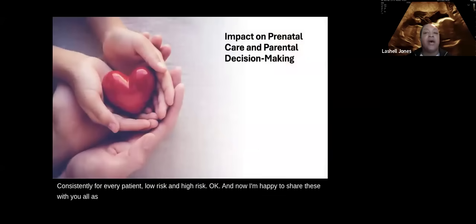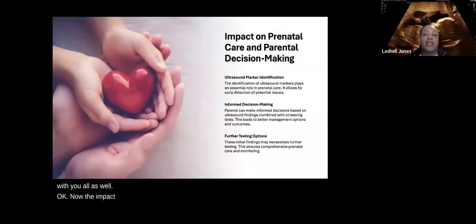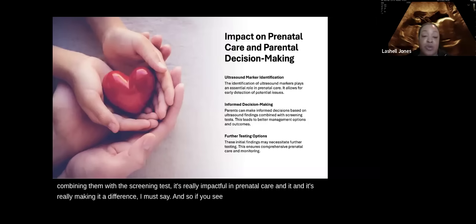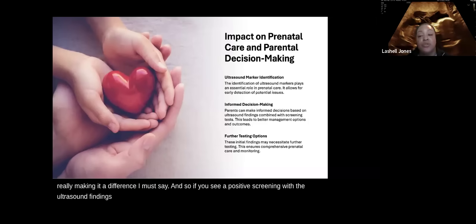Okay, now the impact is tremendous. The impact of these ultrasound markers, as well as combining them with the screening tests, is really impactful in prenatal care, and it's really making a difference, I must say. If you see a positive screening with ultrasound findings that connect the two, then it may lead to a suggestion of additional testing to confirm the diagnosis, which is helpful.